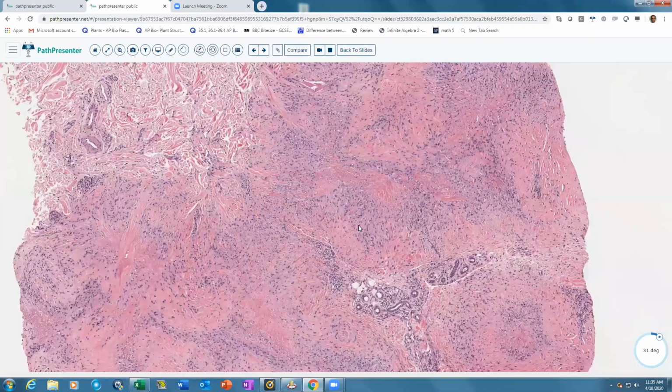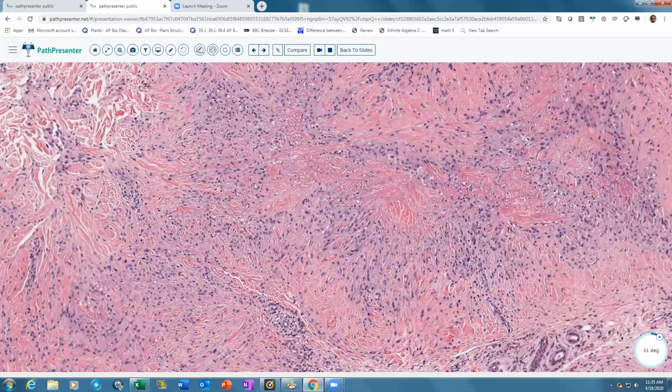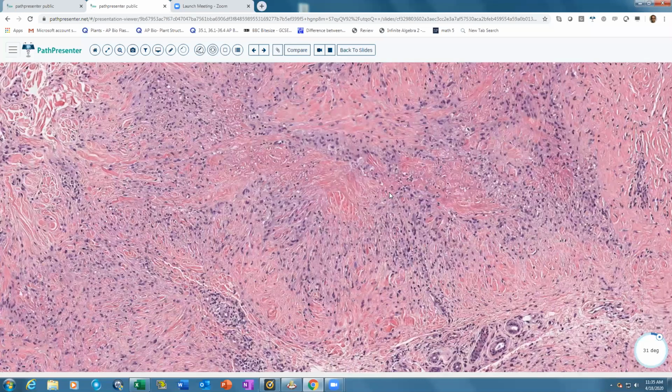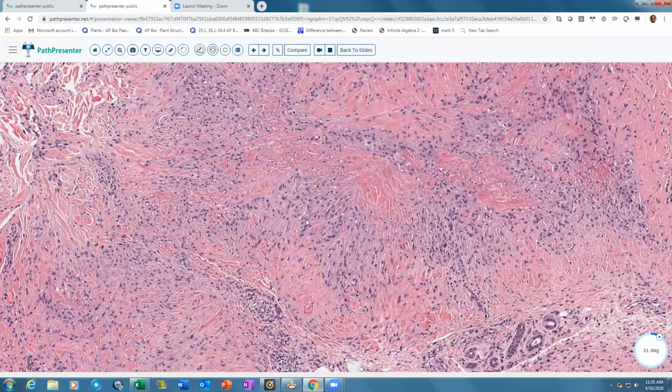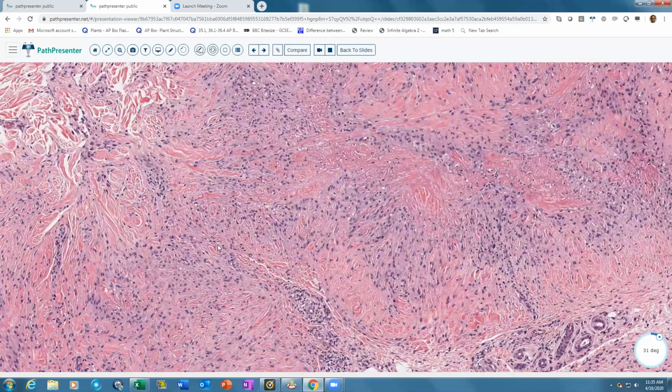And then you have to just go into the center of the lesion and see what you see within the palisade. So in rheumatoid nodule, what we see is a completely necrotic area, very eosinophilic necrotic areas within the palisade. This palisade is composed of macrophages and lymphocytes. In rheumatoid nodule, you might see some plasma cells.